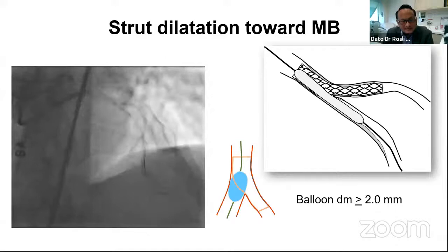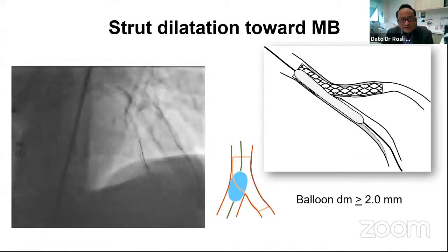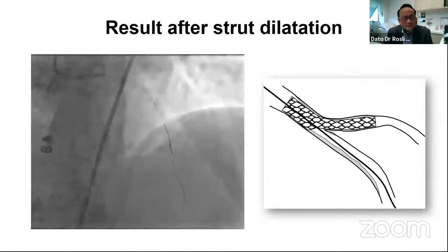Now, the question is, what is the balloon size? At least a diameter of 2.0, if not larger, because you need that amount of balloon dilatation to allow the stent to go across. In this case, it's quite safe. You are going to use a 2.5 balloon to dilate the stent struts. Once you have done that, then these are the results after.